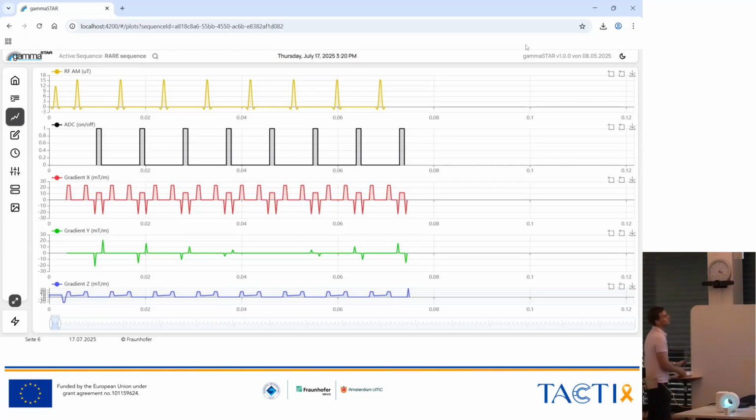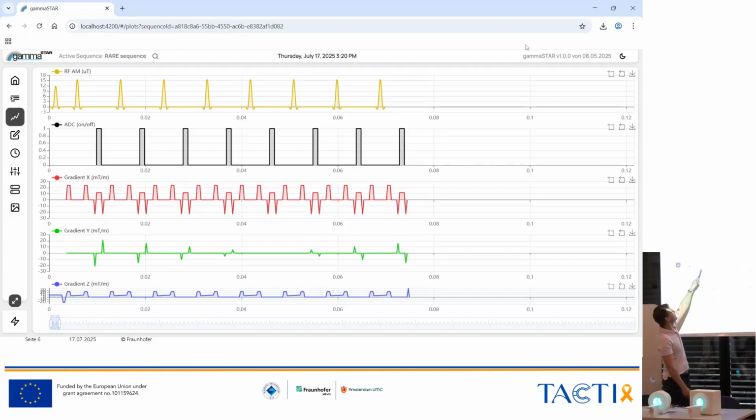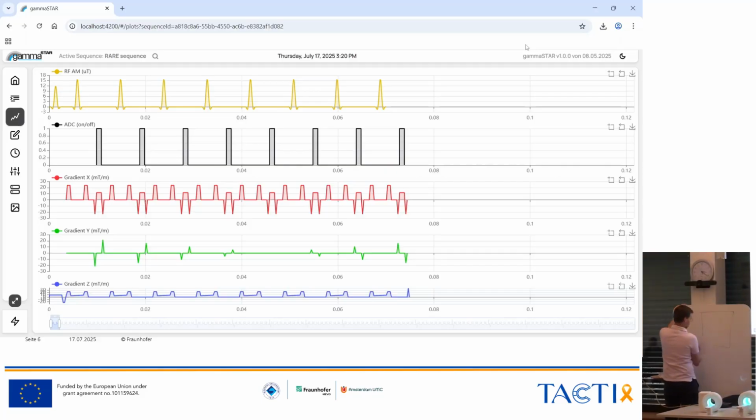As I mentioned, we have a change in signal intensity, so we have a signal decay. This readout experiences the most amount of signal, and then it decays up to here. If we just read out our K-space from top to bottom, we have a first excitation pulse, a readout, and then we read out the first 8 lines. That would mean that here we would have the strongest signal, and it would decay until here.